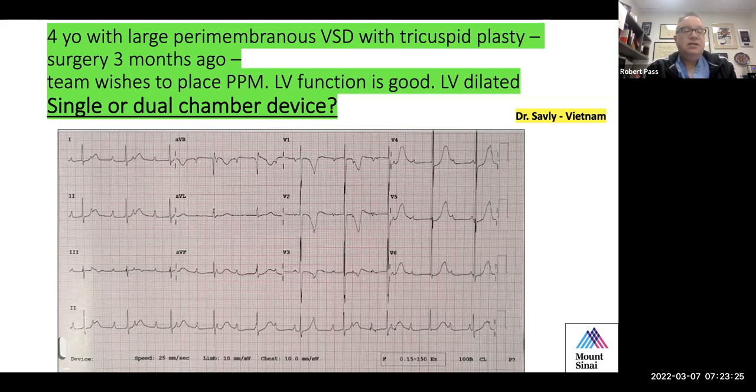To this day, he still has a single chamber pacemaker and he feels fine. I actually had to upgrade his device about a year or two ago. I took a venogram and saw that the vein was open, and I elected not to place a second lead, on the theory that all of these leads eventually break. Because he was doing so well with a single chamber device, I decided to continue it that way.